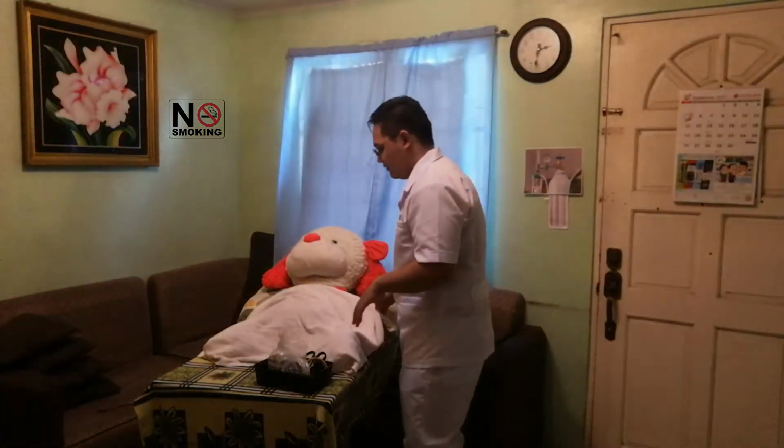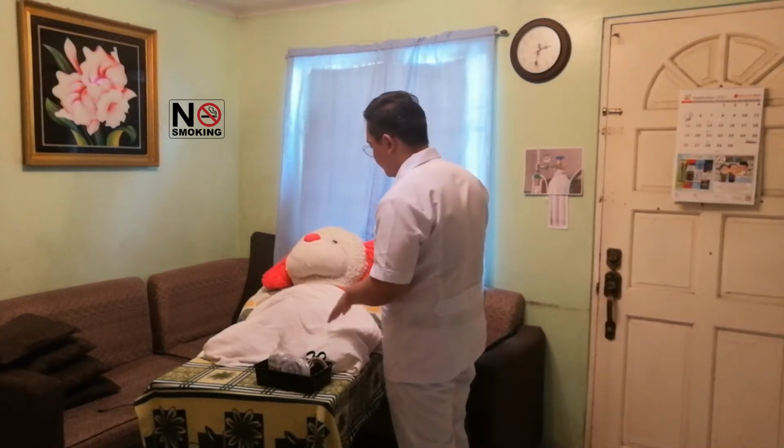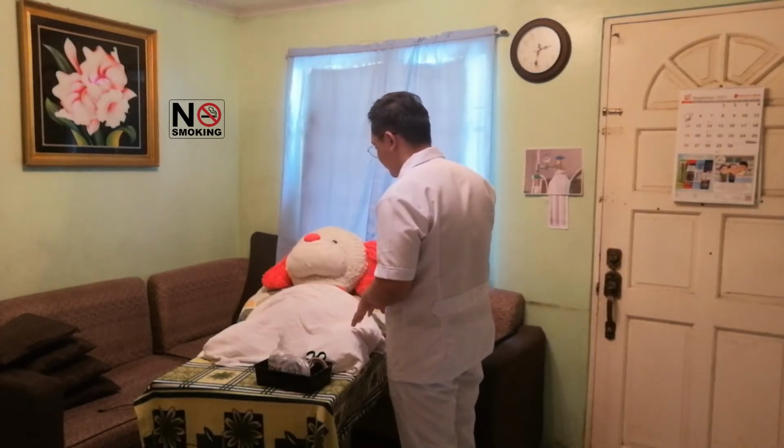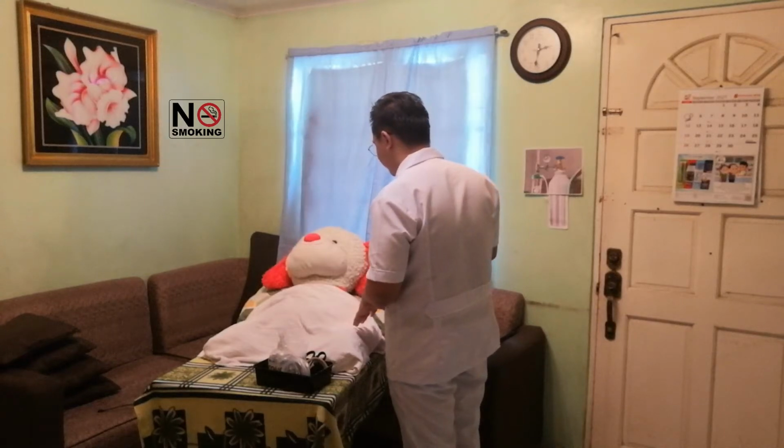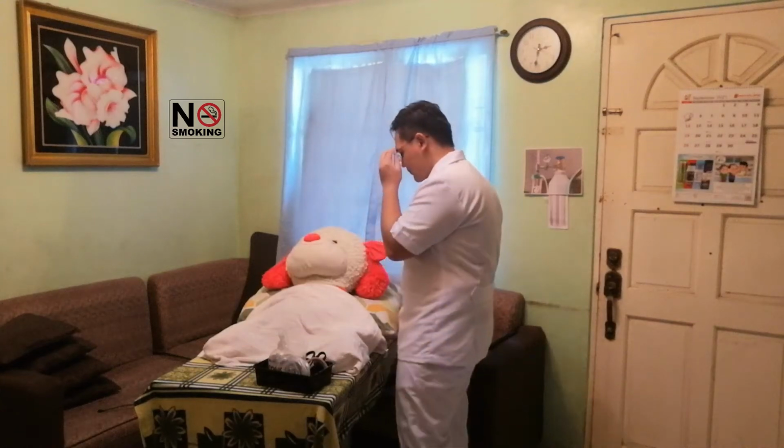And after that, we will move on to our next step, which is we need to explain that the oxygen is not dangerous when safety precautions are observed. Okay, so ma'am, for today po mag-administer po tayo ng oxygen therapy. So huwag po kayo mag-alala, oxygen is very safe po para sa atin. Okay po? Okay. And for our next step, which is our performance.